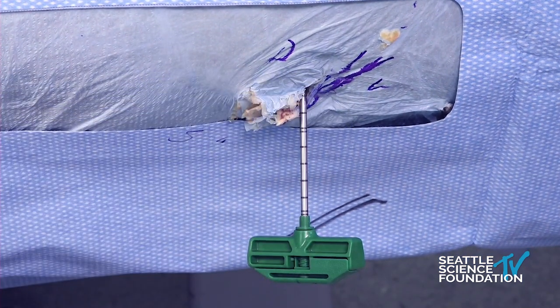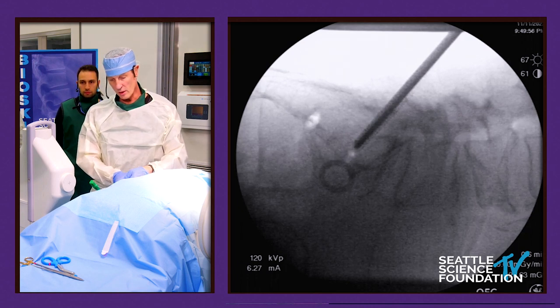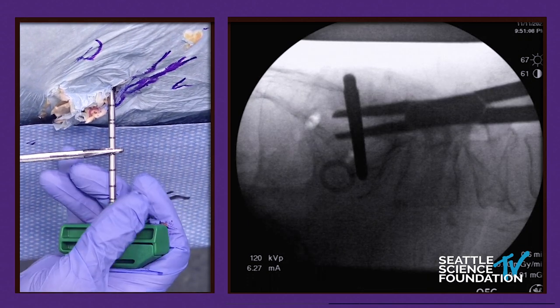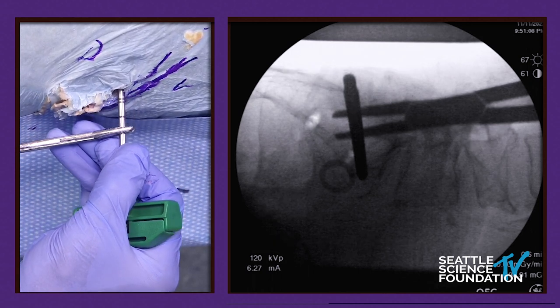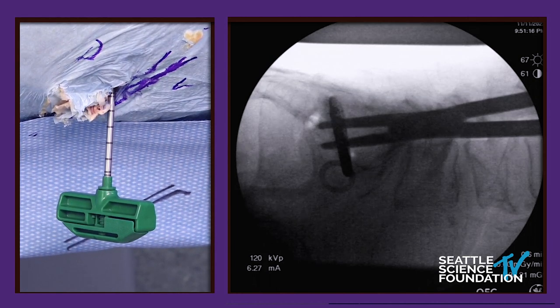We start by lining this up. The three screws we'll put in — I'm only going to put in one today — will be a bony corridor of S1, bony corridor of S2, and a short screw headed toward the S1 foramen.